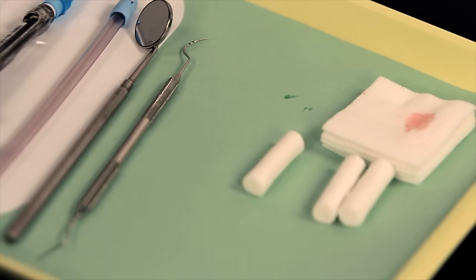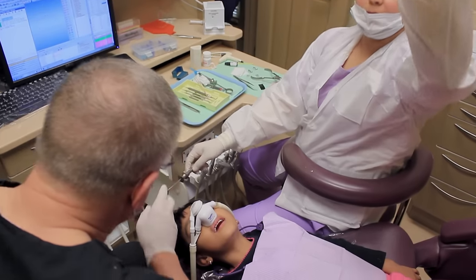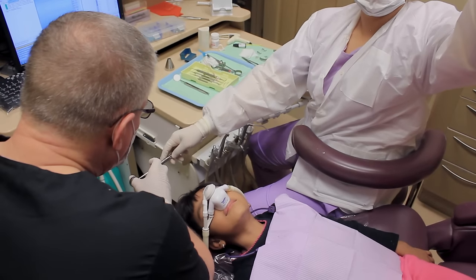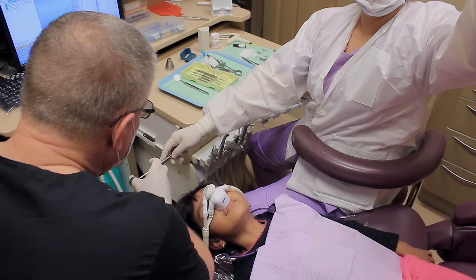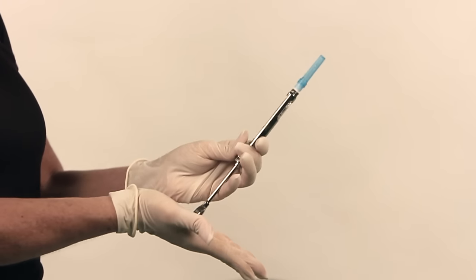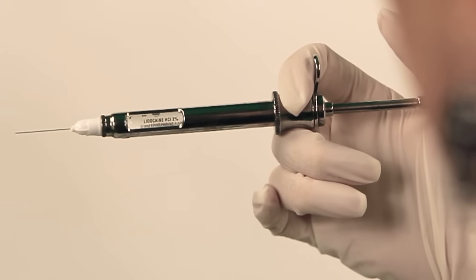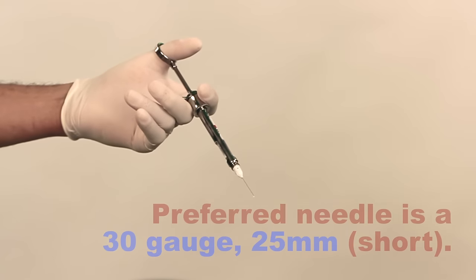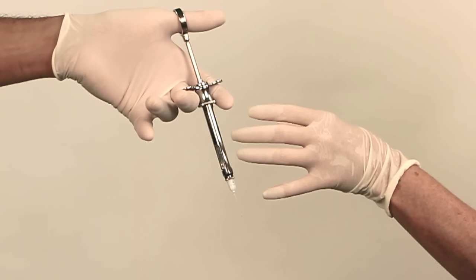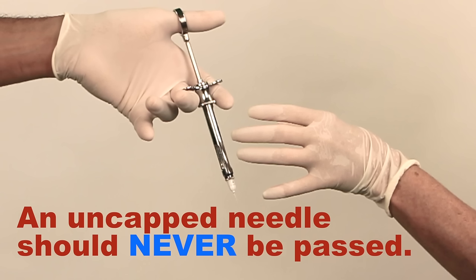Remove the cotton tip applicator and place it on the patient tray. Without delay, the assistant should pass the syringe below and behind the head of the patient. The syringe should always remain out of the view of the patient. Your assistant should ensure that the plunger is fully engaged. As you accept the syringe with the aspiration window visible, your assistant will remove the head cap of the needle and place the cap in the recapping device. Never, at any time, should an uncapped needle be passed from an assistant to a doctor or a doctor to an assistant.